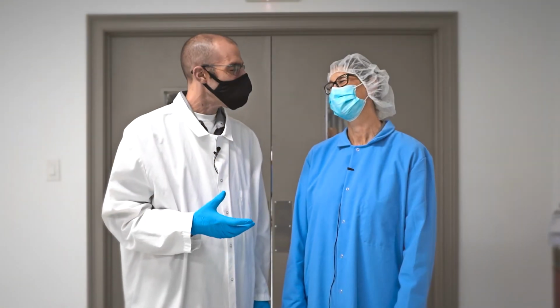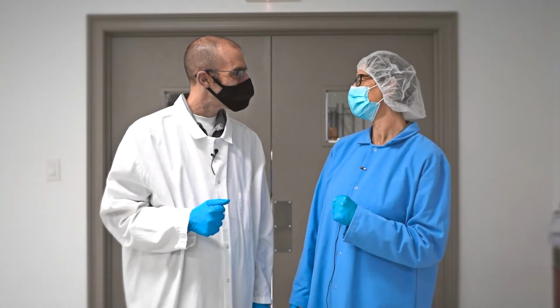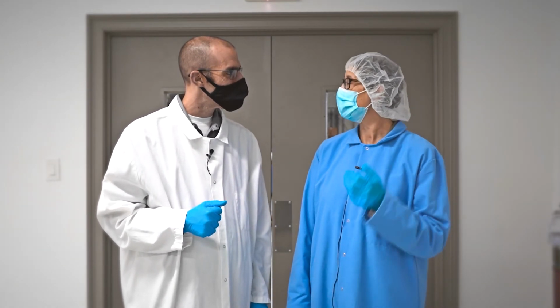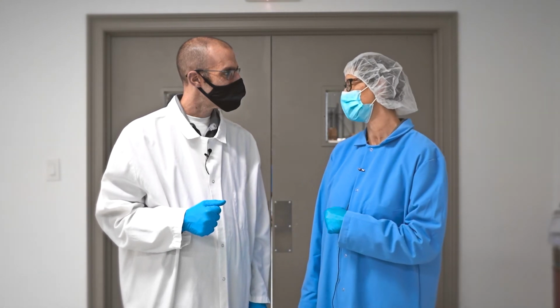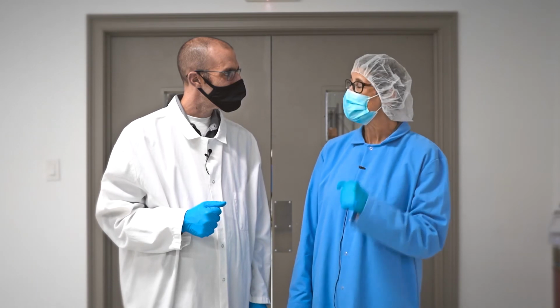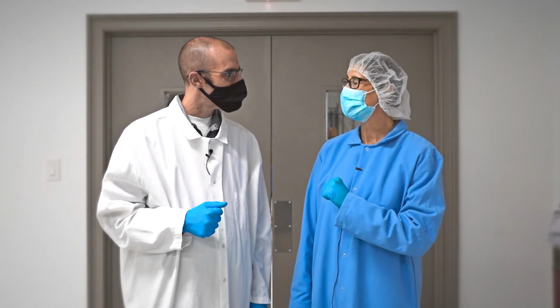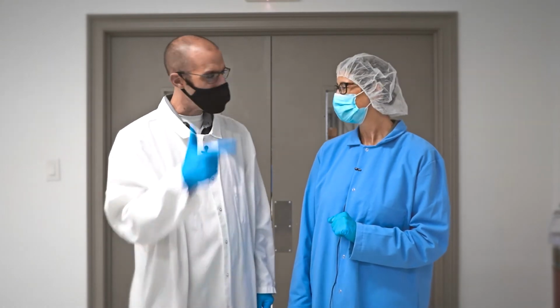We have to be coming to an end of this process. What happens next? We've gotten through quality control. Sandy has let us know that the product met its potency standards. So the next step is to hand off to quality assurance. And Florabelle, who's our quality assurance manager, she will then make sure that all the steps have been completed and nothing has been skipped. So we have QC, and now we go to QA.